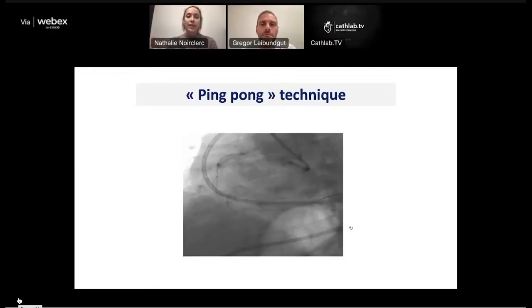The access is really straight, whereas for the radial access, you have to go to the other side. You have to place the arm in the good position, and I think in this situation you must not lose any minute. And when we perform the angioplasty, there is always a radial and a femoral access that is ready. Whereas if we had to use the left radial access, we would have to prepare again to clean it, and it was not ready.